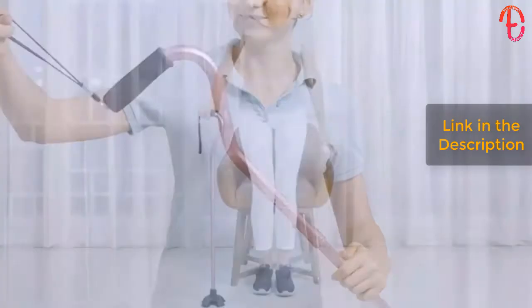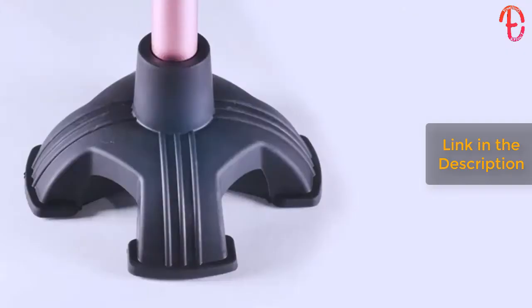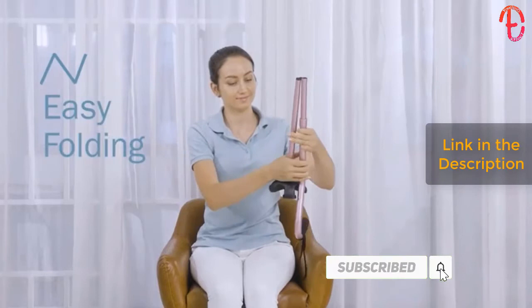This includes pebbles, sand, cement, and even slippery pavement. Climbing off stairs is also easier than before. It stands upright by itself, preventing it from falling and the need of bending down to retrieve it. You can easily fold the cane into half the length for the convenience of carrying and storage.